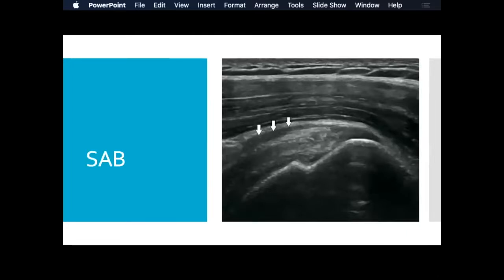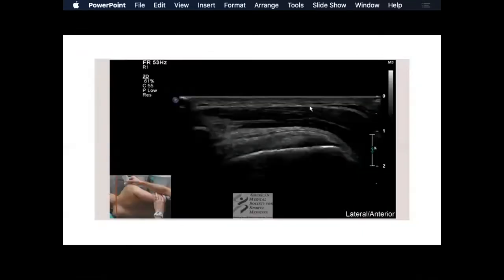And I'll show you how to go after each of these with an ultrasound and give you the steps to do that. And like I said, I brought the Butterfly, so we'll be able to go through something if you want to. As you can see, this is basically the same image we had before. If you look in the bottom left side of the screen, it's called a modified Crass position. It's basically the same position you'd have someone be in if they were reaching to pull the wallet out of their back pocket. And that will crisp up the image that you want.